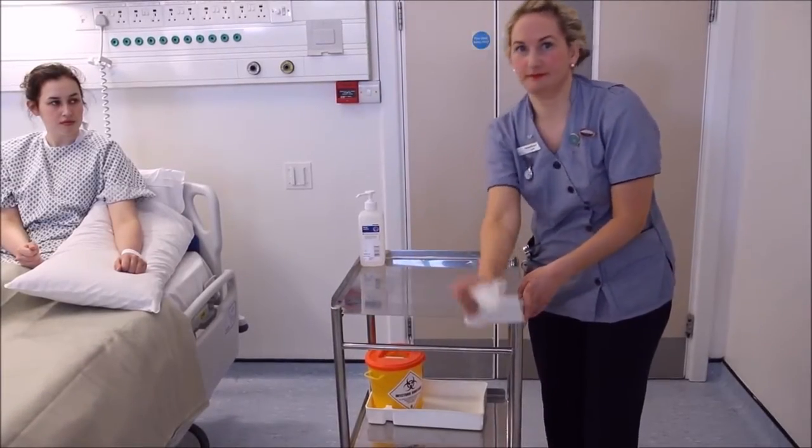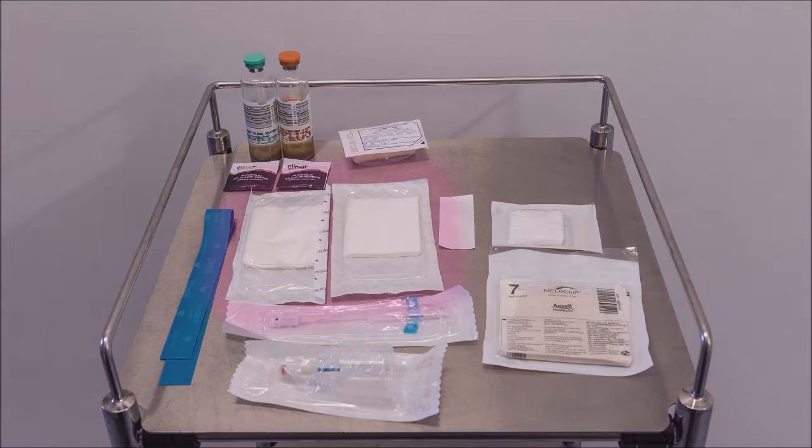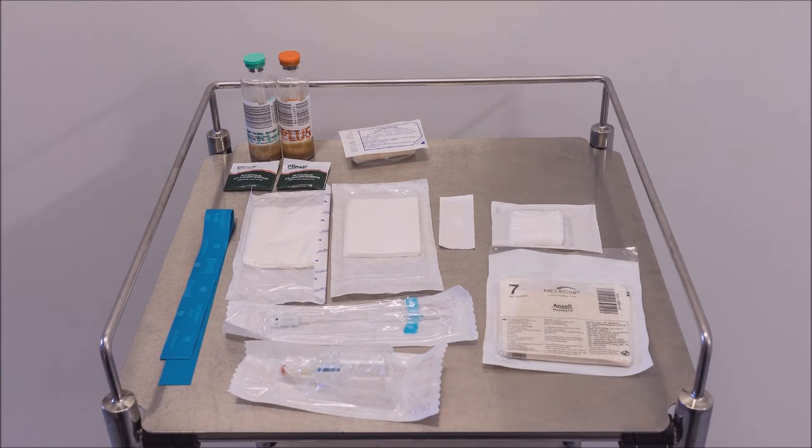Clean the tray according to your local policy. Collect the blood culture pack. Each of these will contain 2 sterile drapes, one for the sterile field and one for under the patient's arm, 2 blood culture bottles, a green aerobic and an orange anaerobic bottle for adults, an adapter cap, a set of sterile gloves, a 23 gauge butterfly, a sterile gauze, a tourniquet, 1 adhesive dressing, 2 chlorhexidine alcohol wipes, and a chlorhexidine alcohol applicator to decontaminate the patient's skin. For pediatric patients, 1 yellow blood culture bottle is required.